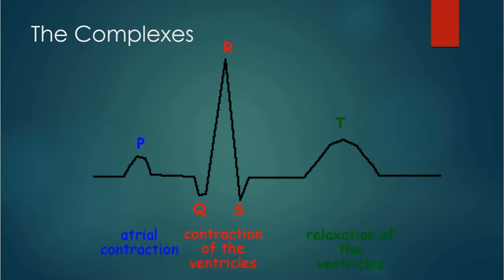Your ECG is not unlike a police officer's radar. It can only clock the fastest car. In the same way, the ECG can only catch the highest energy charge that's coming towards it, okay? In terms of where our leads are placed and where our electrodes are placed. They have ECGs on some cardiac units with well over 100 leads. You can do some research into that. It's pretty neat, and I can't educate you on those. That's way out of my purview. But when it comes to the 3-lead or the 4-lead ECG, if you don't understand those few facts I just gave you, you're going to have a problem, okay?